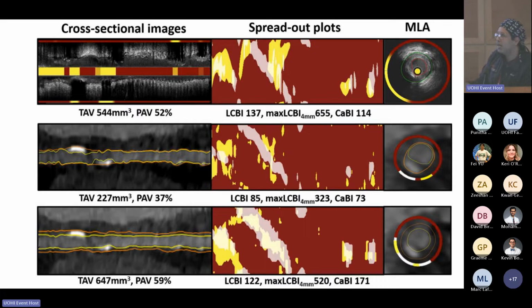The other thing is you're trying to do a PET ligand to a macrophage and then putting it in a PET scanner. I mean, what are the chances you'll pick it up at something that's less than 45 micron? It's very hard to be sure you will even pick it up because there may just not be enough tracer. And if you pick it up, what does it mean? Yeah. Right, but that technique, if I can expand on it a bit, you're right, you're not going to get the resolution, but you're going to get a measure of inflammation that's quantifiable.